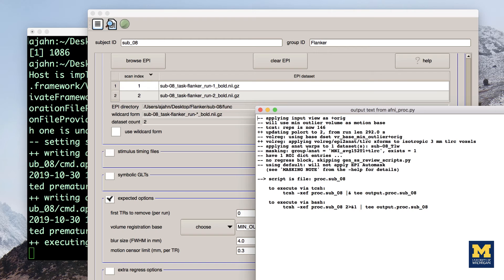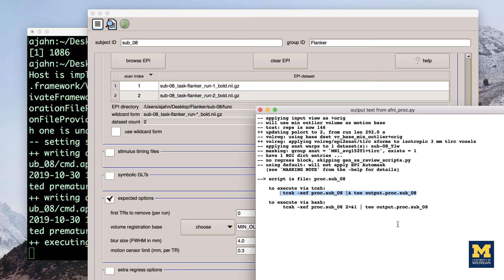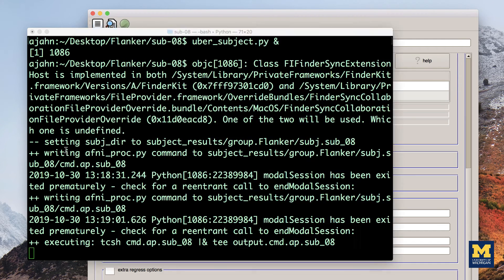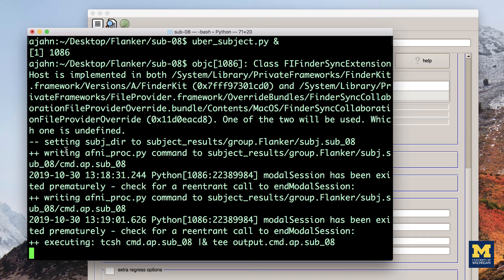You'll also see a couple of lines of code specifying how to run the output of this command, which is a file called PROC.sub underscore 08. Close the window, and go back to your terminal.